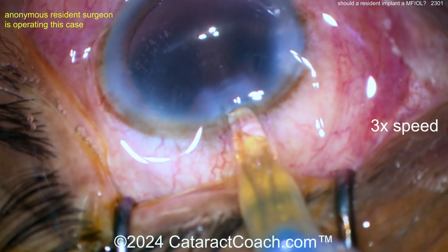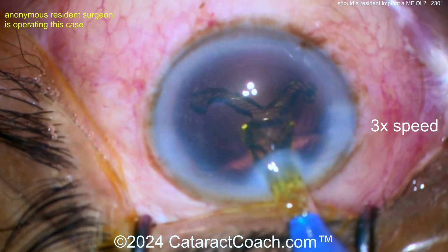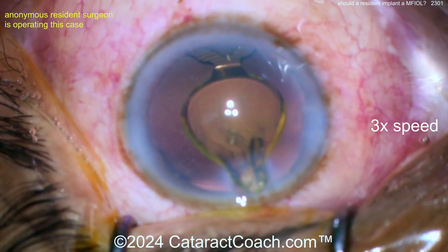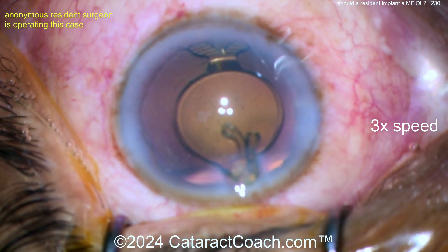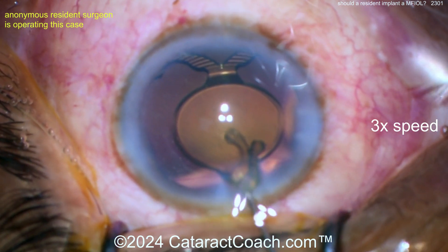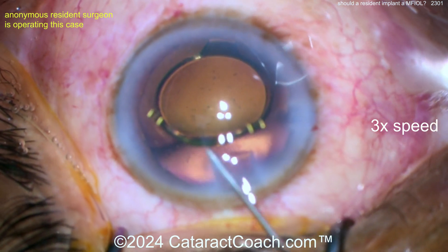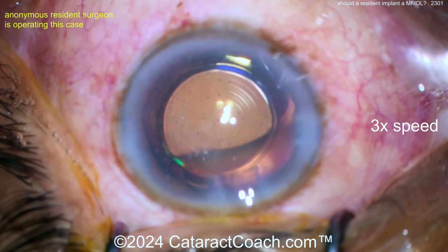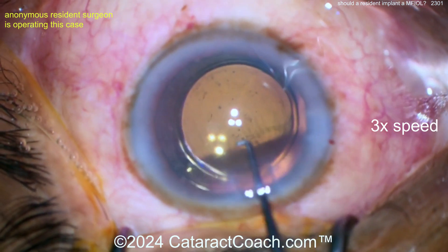Now delivering the lens — going inside the eye nice and easy, getting it in the bag. There it is — it's a multifocal lens; you can see the concentric rings on the optic. This is not a lens I recognize — it may not be available in the USA. It has four haptics; you want to get those in the bag. You also need to center this lens up very nicely.